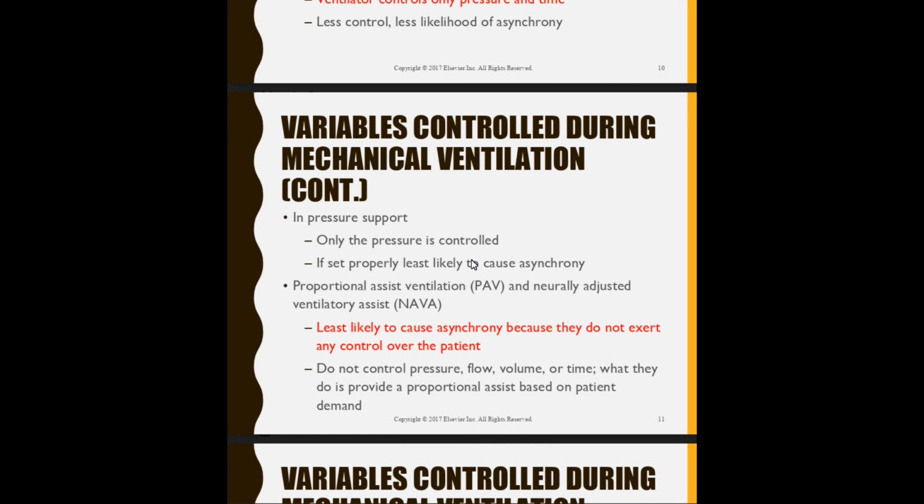With pressure control, inspiration and expiration pressures are controlled. But pressure support only helps the patient on the inspiratory phase of a breath.